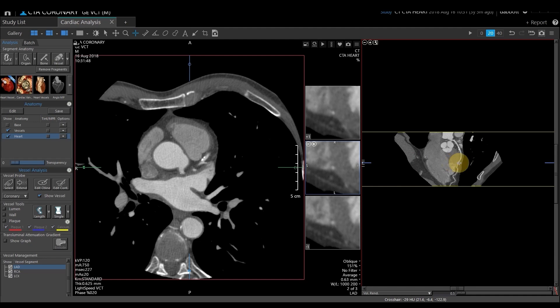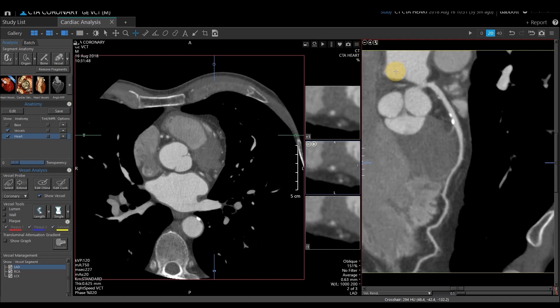This is a little bit small to see. To enlarge it, at the top of the viewport you have a minus, a plus, and a little squiggly line or lightning bolt. If you click that, it's going to enlarge the CPR to fit the screen.